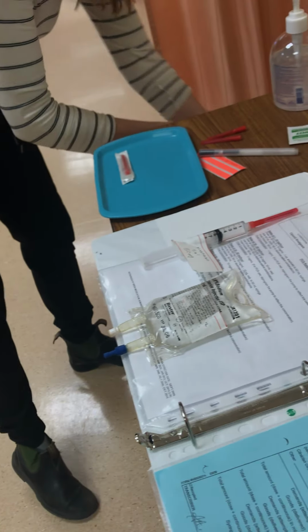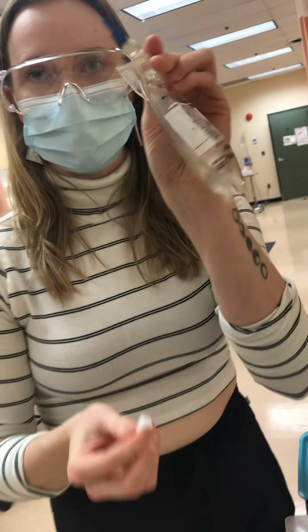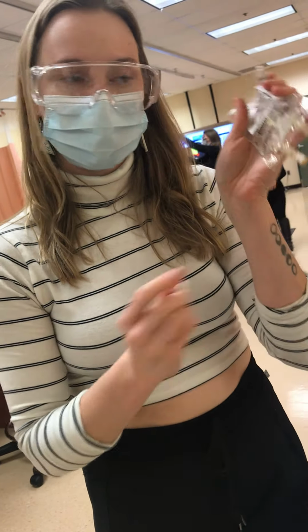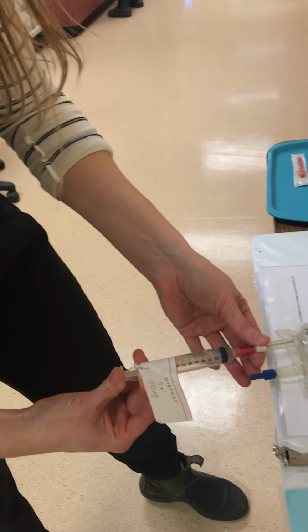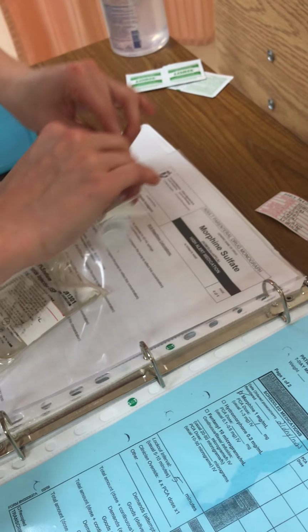So I would quickly grab. You know what? One of the things I actually realized is I'm not sure if I sanitized this before taking out the normal saline at first. So one of the things that I would have done is I would have cleaned my mini bag for 30 seconds and let it dry for 30 seconds sterilely before drawing the 5 milliliters of normal saline. So I'd put this in and ensure all of it is injected. Move this and close this.